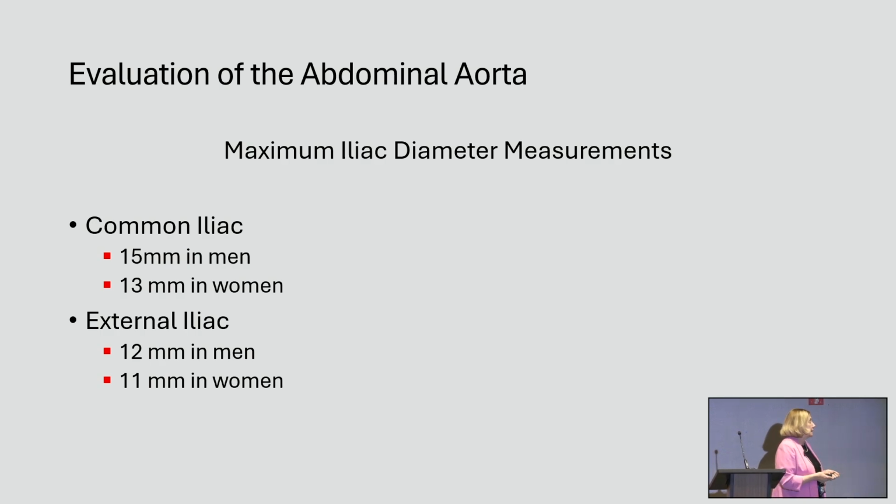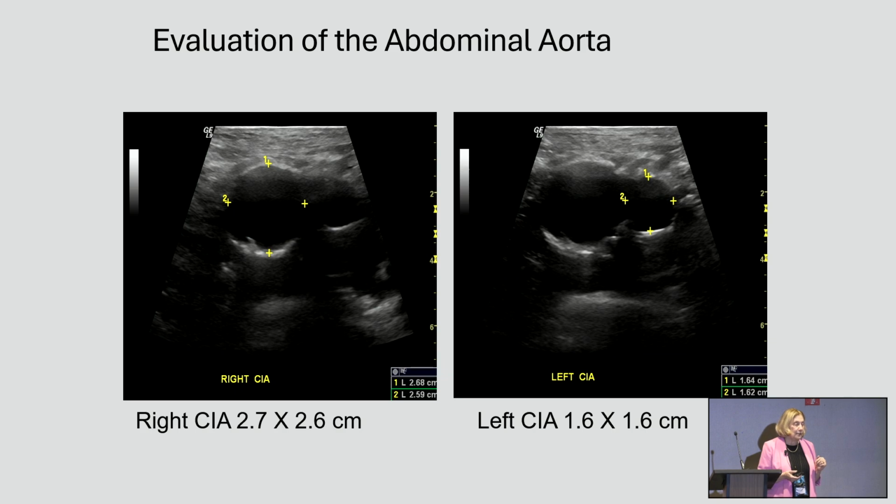All right, so common iliacs, and again, varies a little bit. This is data that I've seen that's been out there for quite a while. I think it was Pollack and Pellerito's book, and I don't know who else before that. But these are some benchmarks, kind of. And again, anything that is an average or a typical can be atypical in your patient. So we have these measurements, and I don't tend to read to you on this. Look at this, and then also you can get this data and these criteria, and they should be there in your lab for you to look at.